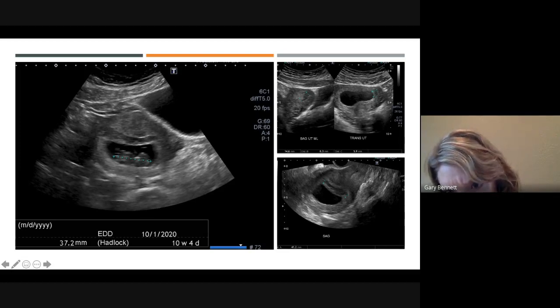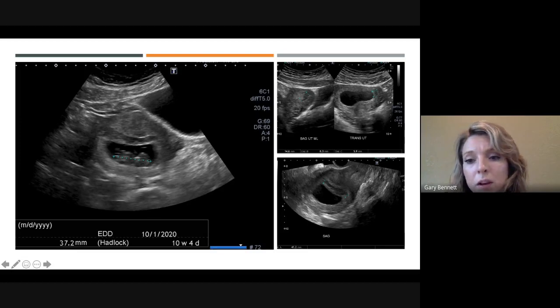So it's harder to trace exactly where we're going. It looks like probably right here, because this is the cervix. That little dot right there, that's a Nabothian cyst. Not concerning, but it just kind of helps us determine where the cervix is on this picture. So this fluid, if it's going to leave, it can probably leave without any problems because the gestational sac is over here.